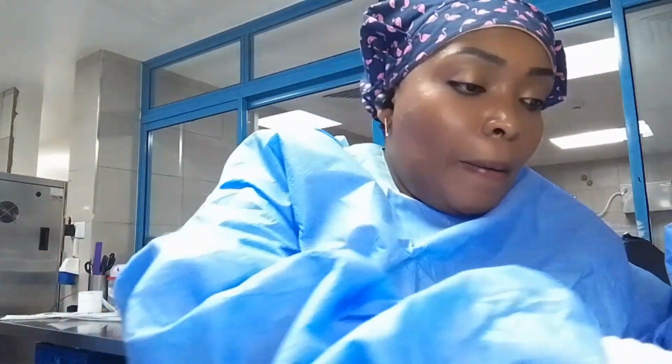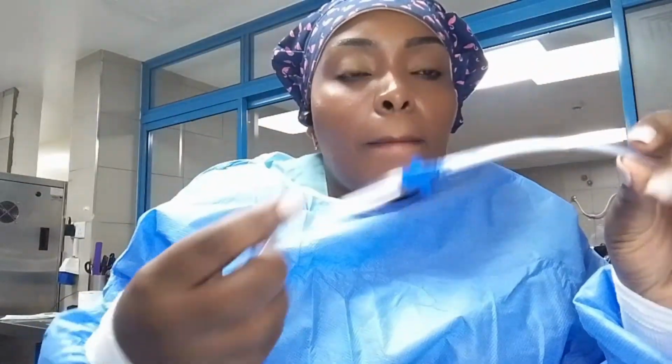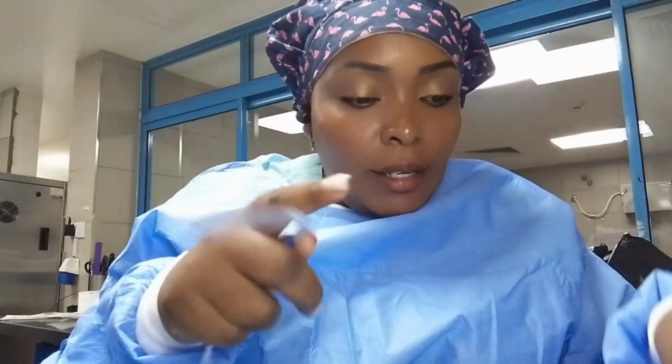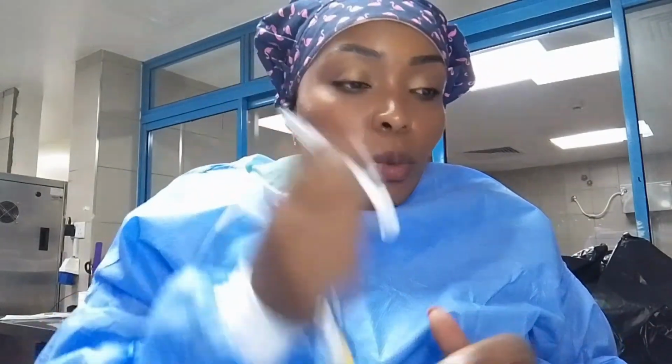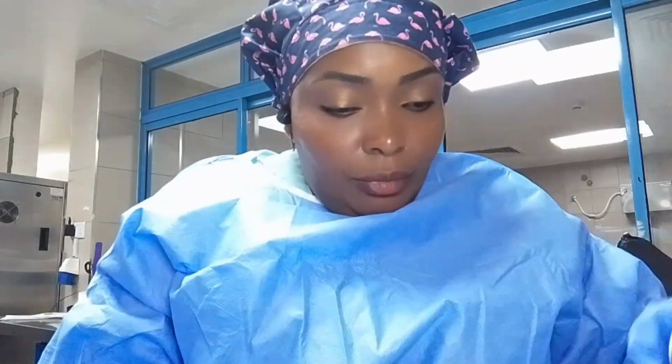You see here, we have 2 things. Before you start using the central line, you have to prime it. That's why we have this here. You have to prime your line. You don't place it in your patient without priming it. And after you've placed your central line, you use the suture to suture the place.